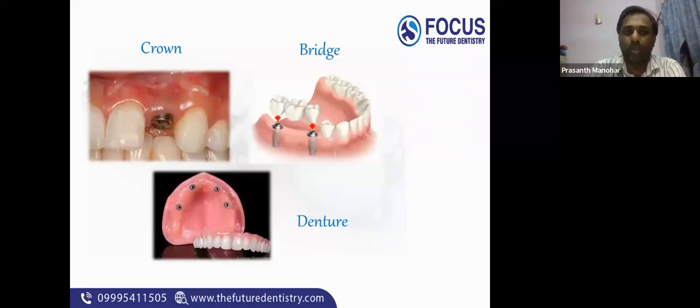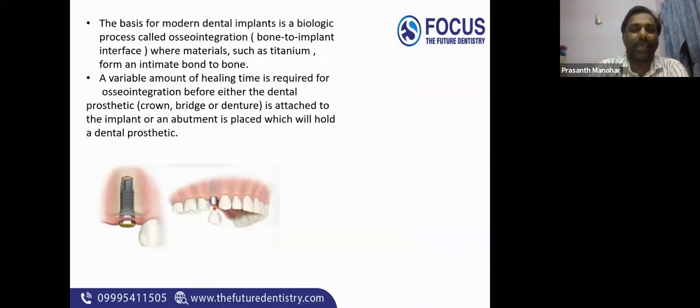So it can be used for a single crown replacement, for multiple teeth missing, and for supporting the denture. Basically, dental implants are made up of titanium.